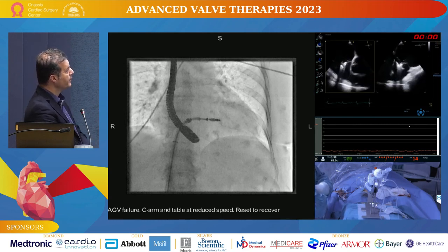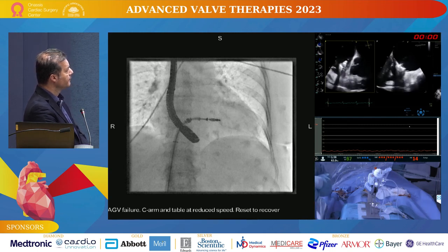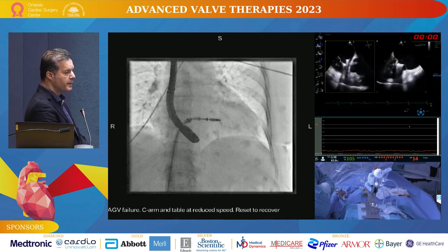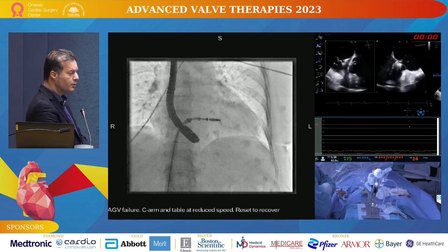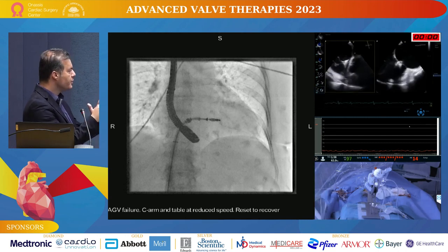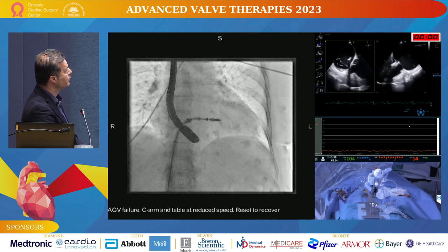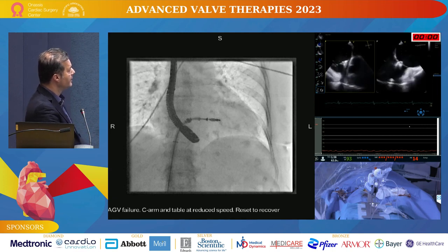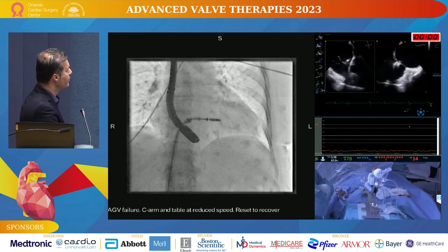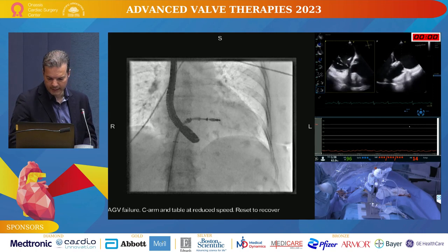We always record the grasping. This is the recorded part of the grasping. We take a look at it. It's worth spending a minute or two on that because sometimes by closing, a few millimeters of the leaflet may slip out of the clip. So this is the recording. We're checking again. We're happy with that. And then in a minute, we're going to release.